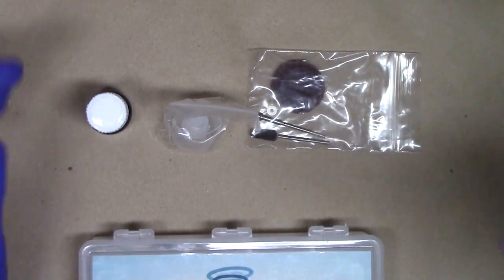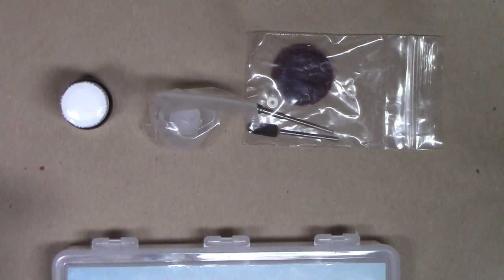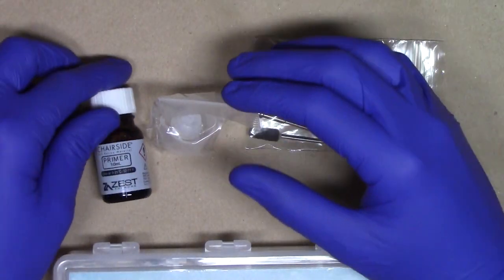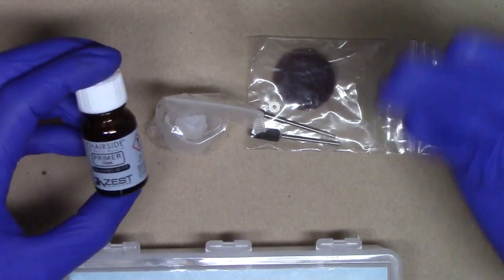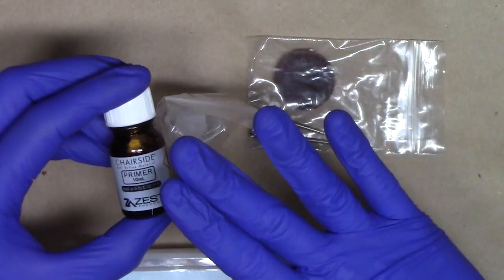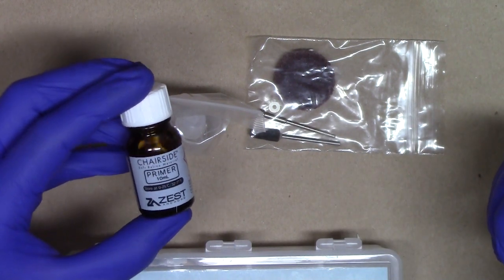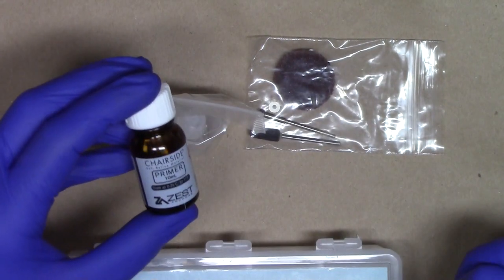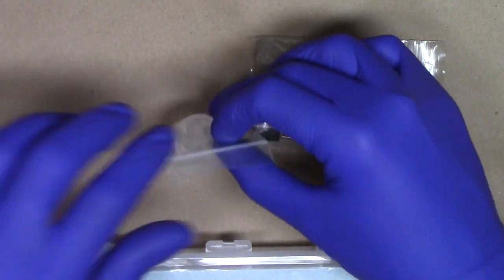Now, since this is a silicone-based product, I'm going to zoom in a little bit, there is no true bonding of the soft liner to the denture without the use of a primer. So Zest has ensured that a primer is included in the packaging for the soft reline material, and this is really critical to use to ensure that the soft liner properly bonds to the denture.